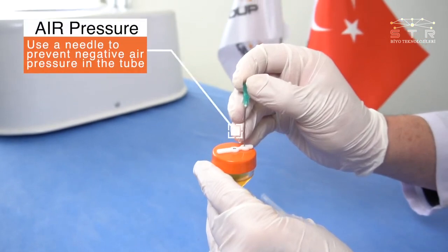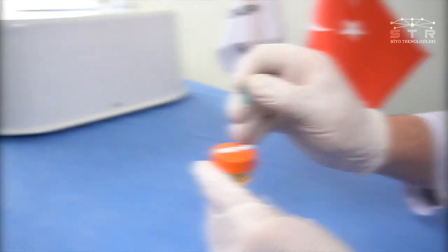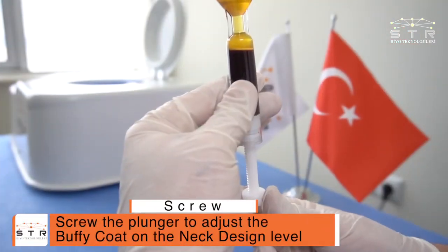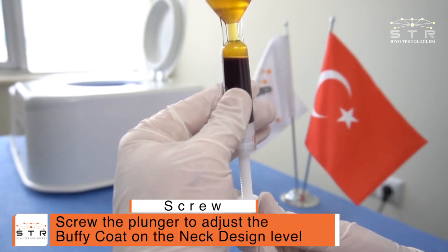Use a needle to prevent negative air pressure in the tube. Screw the plunger to adjust the buffy coat to the neck design level.